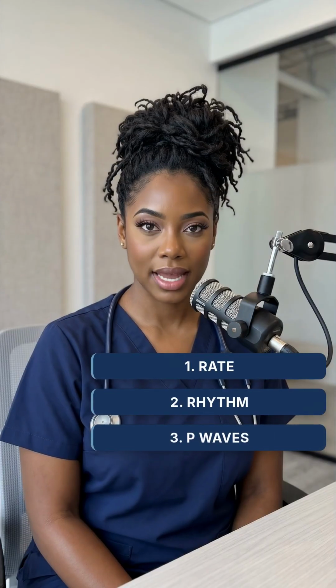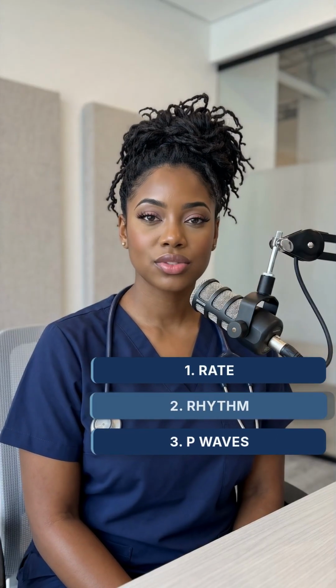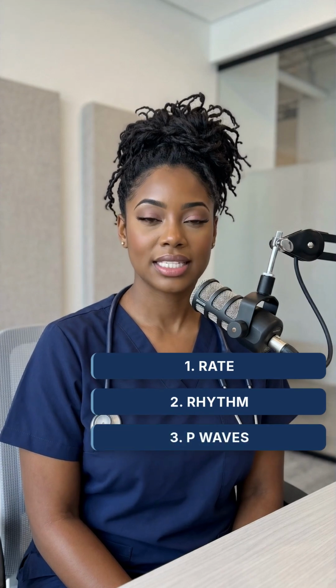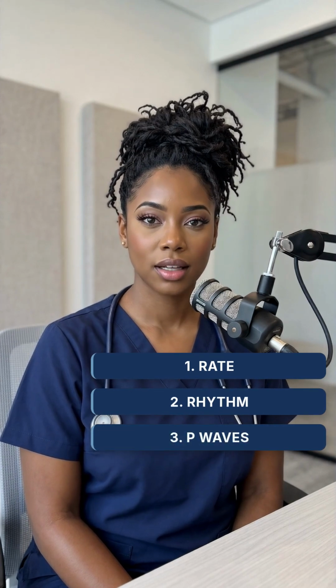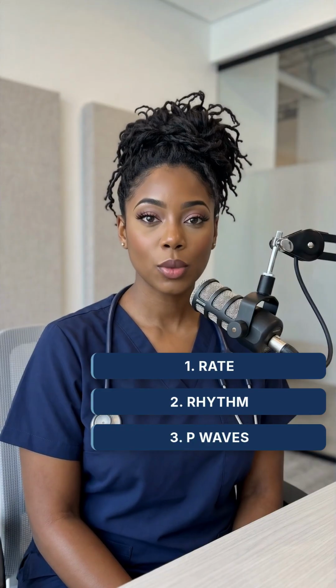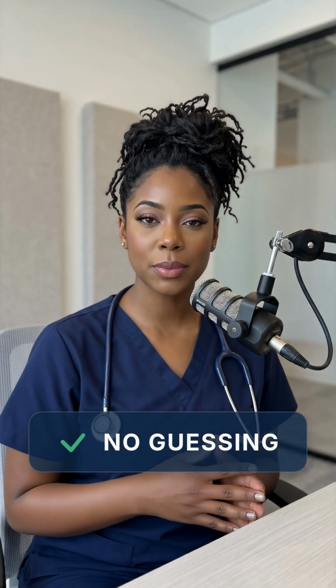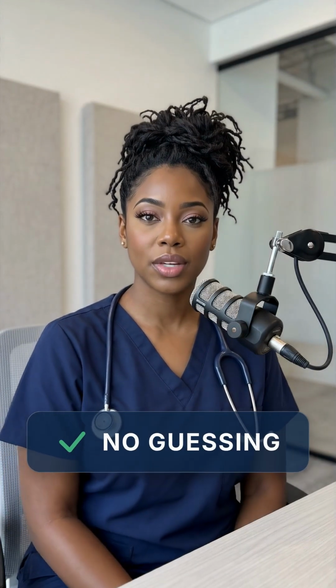Alright, here's the method I want you to use every single time you look at an EKG. 3 steps. That's it. Step 1. Check the rate. Is it too fast, too slow, or normal? Step 2. Check the rhythm. Is it regular or irregular? Step 3. Look for P waves. Are they present? And does each one lead to a QRS? If you follow those 3 steps, you can break down most rhythms without guessing.